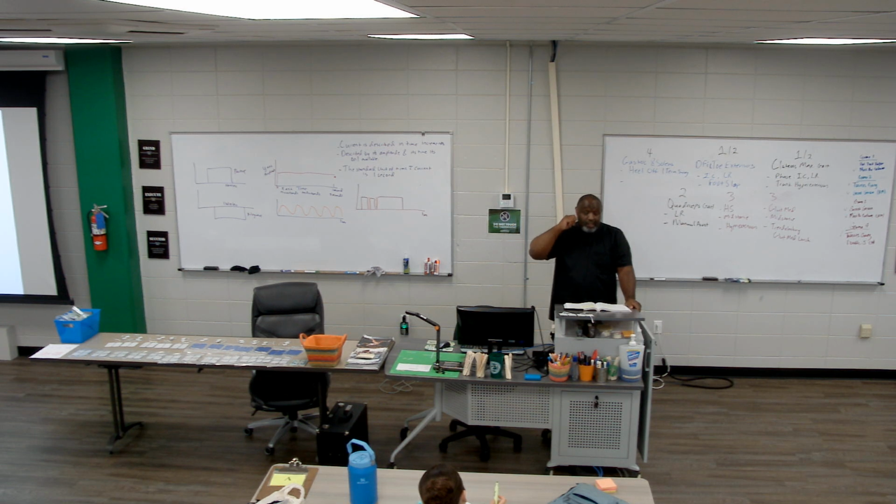So if I'm trying to isolate my bicep, sometimes using symmetrical biphasic will hit my bicep, and it may overflow into my tricep or my deltoid. So the current overflows, it pours out and doesn't stay specific sometimes. Therefore, asymmetrical balanced biphasic may be a better choice for small muscles.